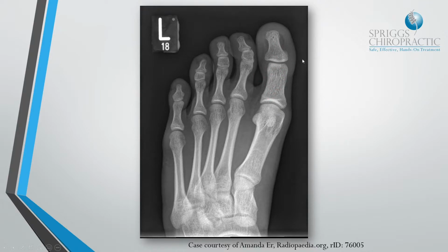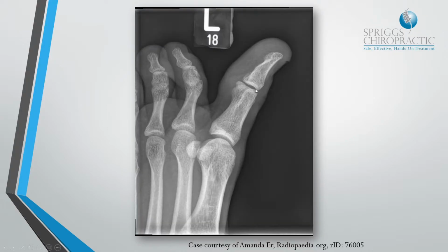So this is where you can evaluate all of the toes as a group, or you can try to shut them down and take them as individual projections, but you will always get other toes involved. You will never be able to separate the toes out far enough to evaluate them in isolation. However, this is the big toe being evaluated in more of a lateral projection. So the central ray is the metatarsophalangeal joint of whichever toe is being evaluated.